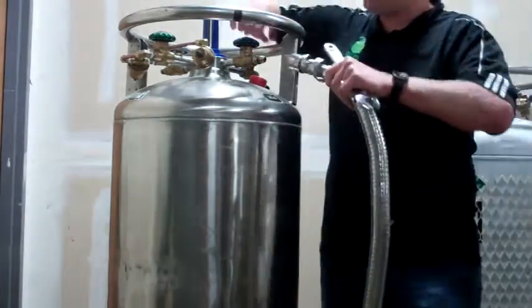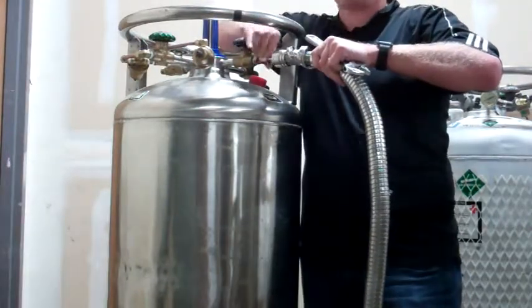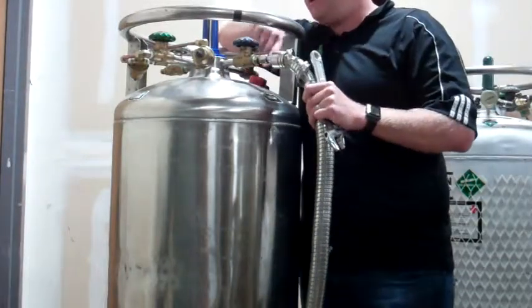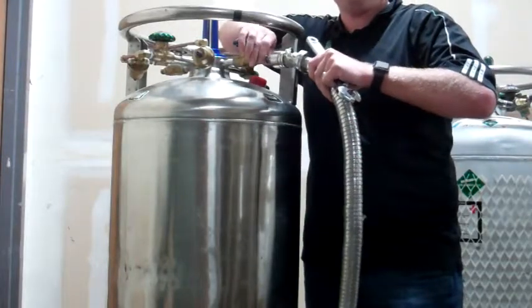If while you're putting it on you feel any resistance, or you see any brass flakes falling down on the tank, you're putting it on at an angle and you're stripping the brass fitting.